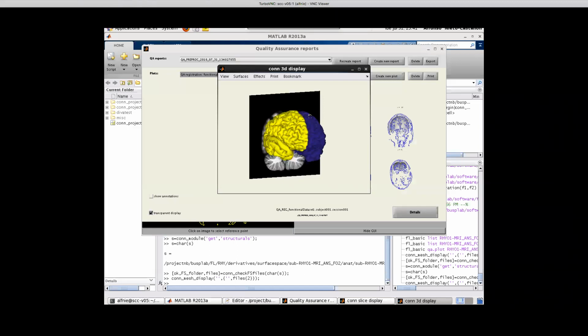Right. Exactly. So it would make sense for that subject surface thing to be in the first level QA. Right. Yes, although anytime we look at speech minus baseline, that is our first level QA thing.